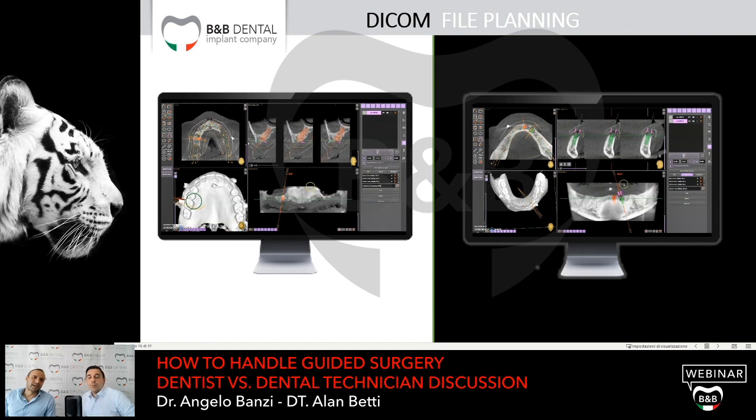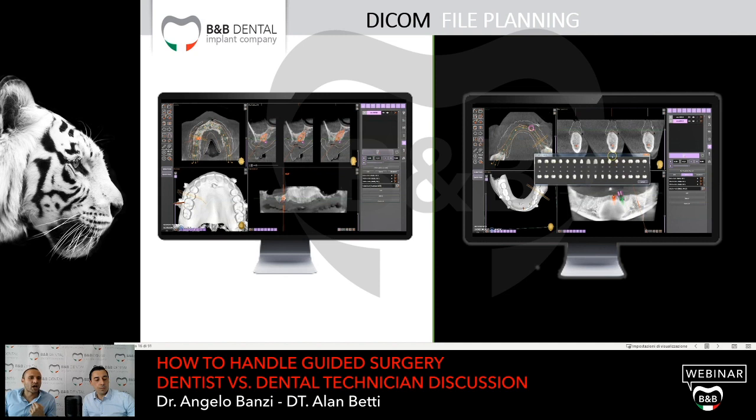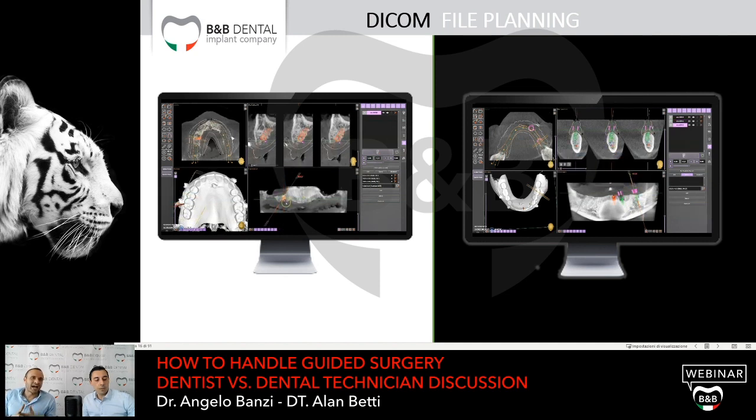But I was saying that I'm starting with the measurement of soft tissues and bone tissues, because I know everything about the type of abutment and implant that I'm going to use. With this technique, I'm going to manage everything. I'm going to decide the type of implant, the position of the implant, the inclination, the abutment, the length of the neck of the abutment, which type of abutment. I can check for the parallelism.